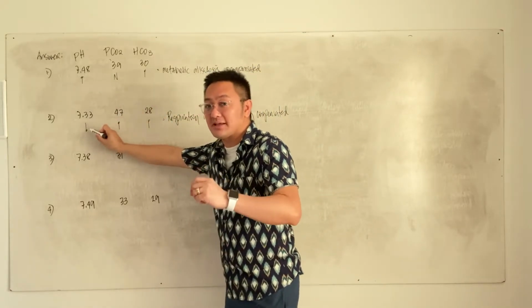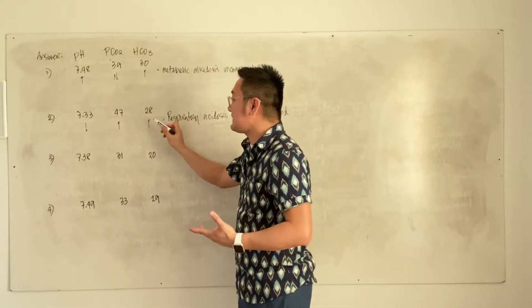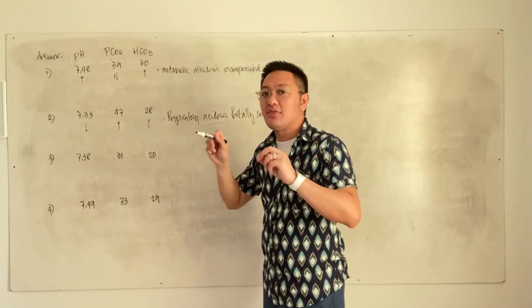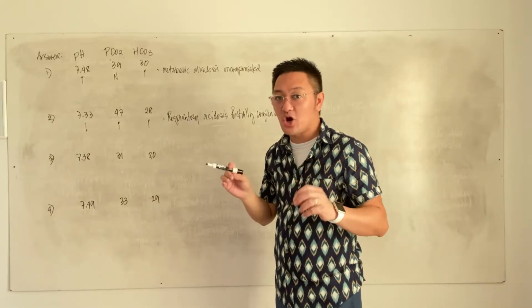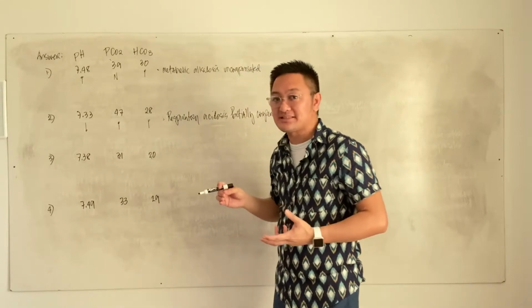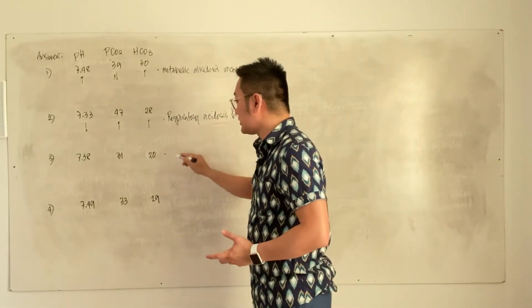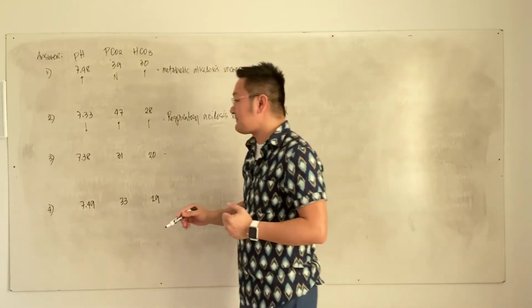The problem there is the other system is trying to compensate by increasing bicarb but failed to normalize the pH. That is why the compensation there is not successful. The compensation there is only partial. Okay, so this is your partially compensated. So that must have been your answer. Okay, now what about here in your values, in your number 3?